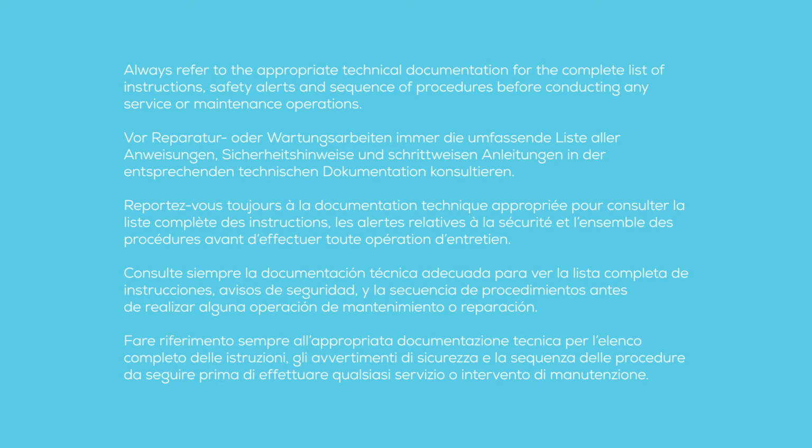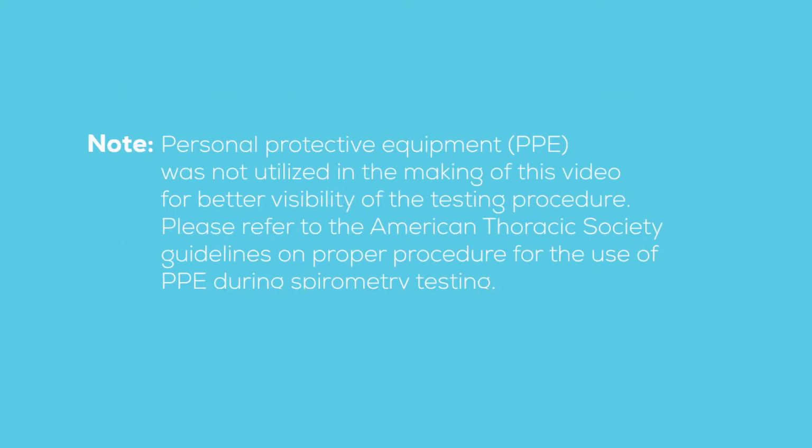Always refer to the appropriate technical documentation for the complete list of instructions, safety alerts, and sequence of procedures before conducting any service or maintenance operations.